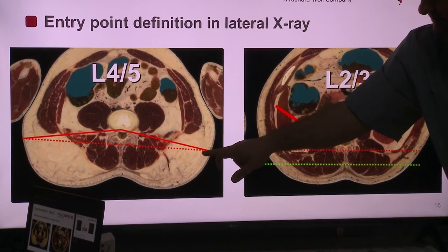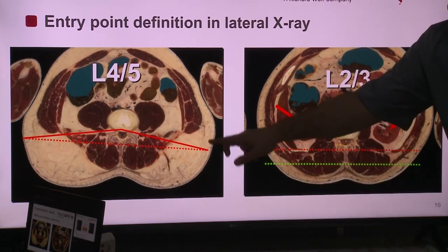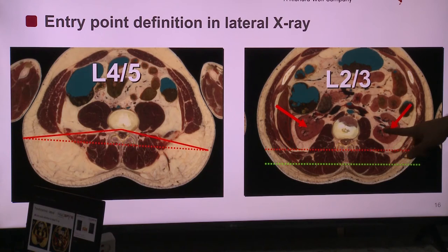Yeah, this is the limit. That's why it's red. Red is stop. Yeah, you cannot go more anterior. But the green line, and also you cannot use the red line above three, four level in the upper levels because there is a kidney here, and that's why we defined another line. It's green, and you can use the green line for each level.